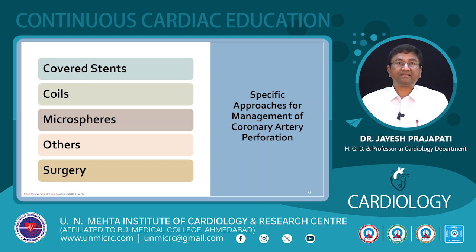It is better to use a 7 French guiding catheter when you use a ping pong technique that I am going to discuss. So the cover stent issue with the Graftmaster is very difficult to tackle, but the Biotronik Papyrus is very good to tackle. At the site of perforation, you can deliver the cover stent by two means: single guide, 2 wire technique, or a double guide or ping pong technique that I am going to discuss.